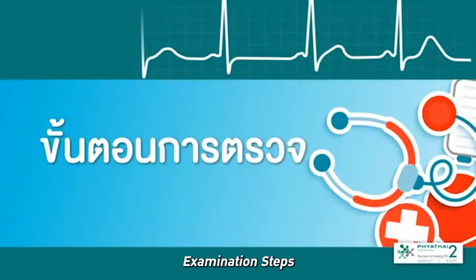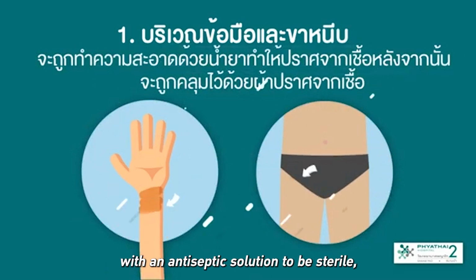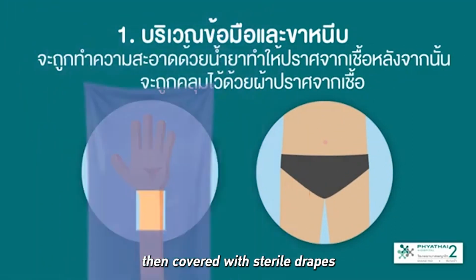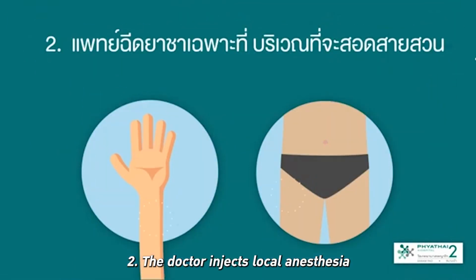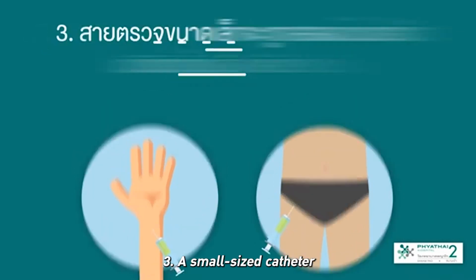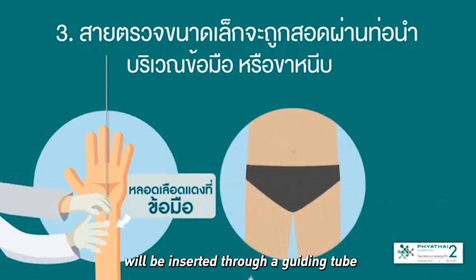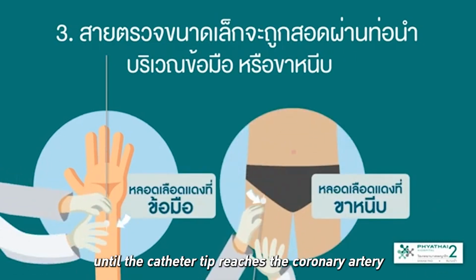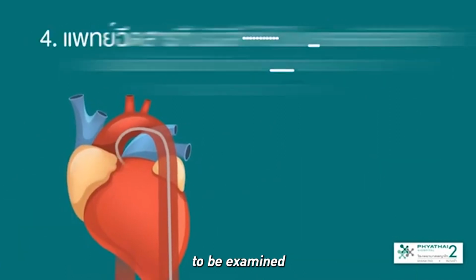Examination steps. 1. The wrist and groin area will be cleaned with an antiseptic solution to be sterile, then covered with sterile drapes. 2. The doctor injects local anesthesia at the site where the catheter will be inserted. 3. A small-sized catheter will be inserted through a guiding tube at the wrist or groin area until the catheter tip reaches the coronary artery to be examined.